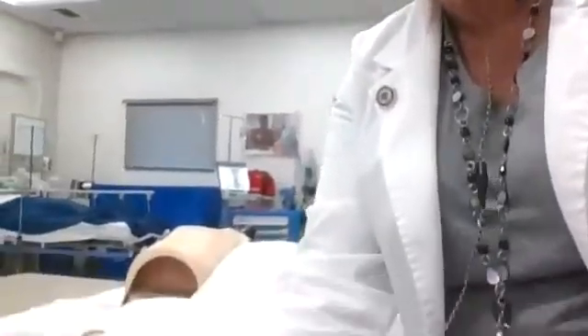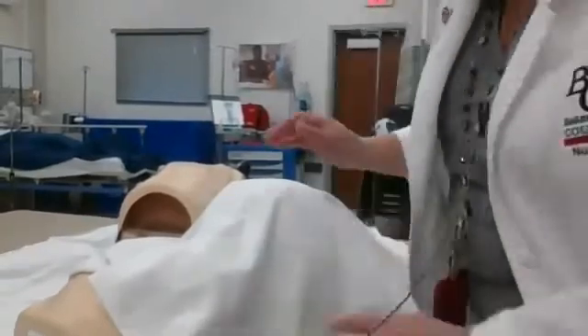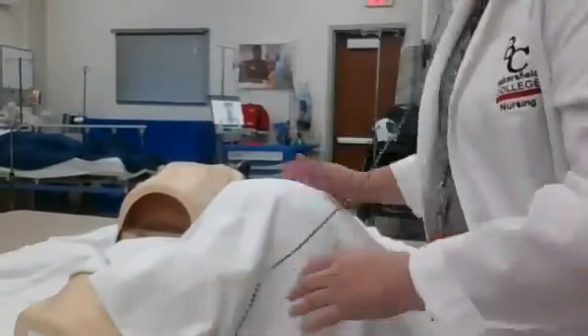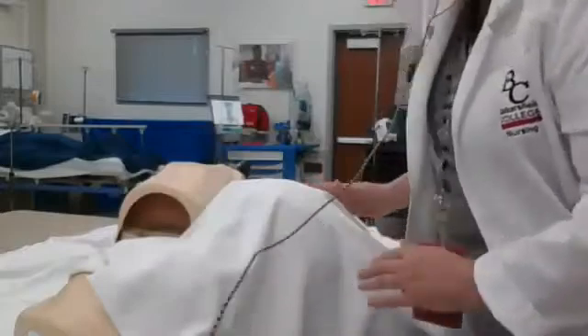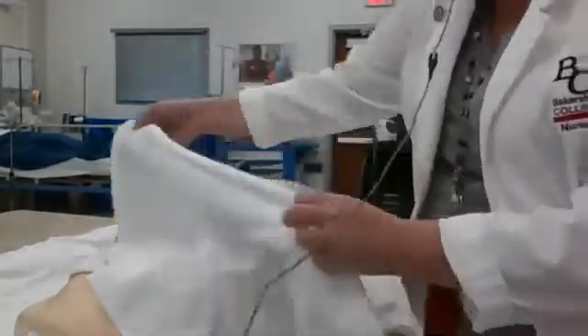Hello students. I'm here in the skills lab and I'm going to show you some of the unique skills that we will be using in the labor and delivery unit. I'm going to move my camera down so you can see we have our patient here. Yes, she is headless but she has the rest of the parts. I'm going to show you how we would put a patient on the fetal monitor.